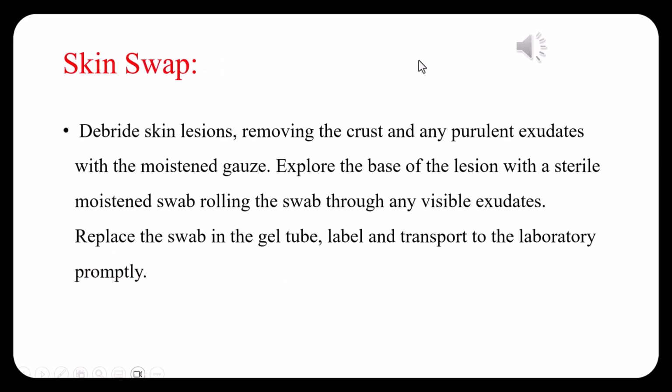So here we have the skin swab. The skin swab is also a skin sample. Here it is not like blood; there is another sample, but it's the same thing. We have a lesion or any injury. If we have a deep lesion, we can put the swab into that infected area, or onto a superficial lesion.